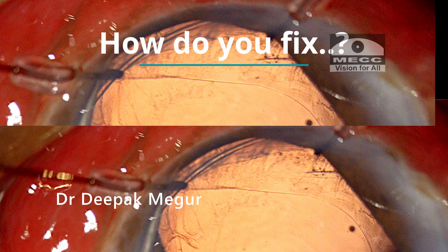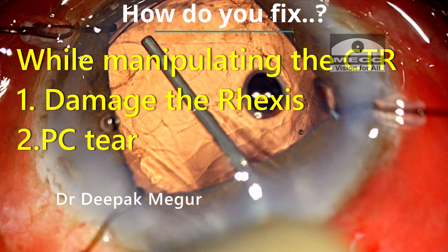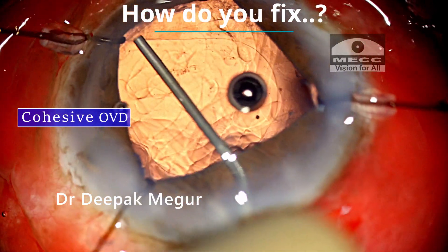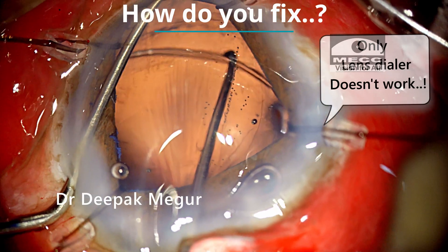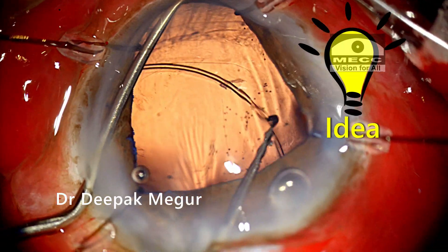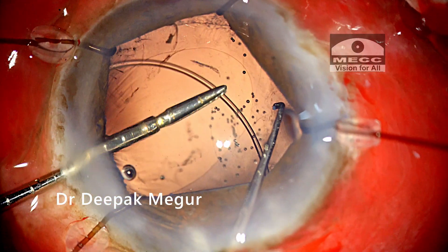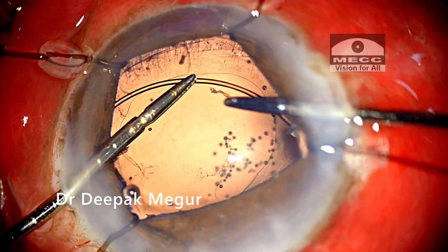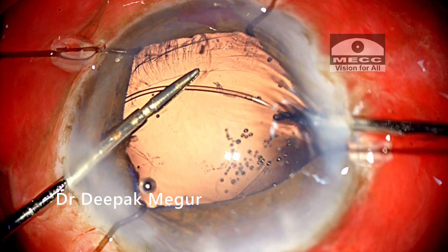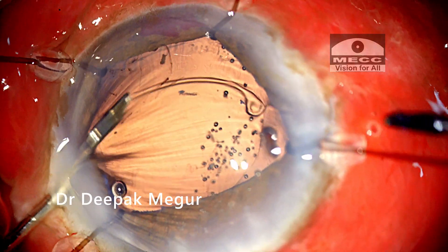Now, how do we fix this? I need to be aware that while manipulating the CTR I can potentially tear the rhexis margin, or cause posterior capsule rupture by forcefully pushing the CTR into the bag. The first critical step is to inflate the bag with cohesive OVD to create more working space. I try with a dialer, but this does not work. I then realize the best approach is to use a micro forceps — an end-grasping forceps — in one hand, bring the CTR centripetally using a lens dialer, grasp the CTR with the forceps, exchange the dialer for another forceps, and slowly thread the CTR into the bag using a bimanual technique. This is the best and safest way to manage such situations, and it highlights the importance of having good quality micro forceps readily available.